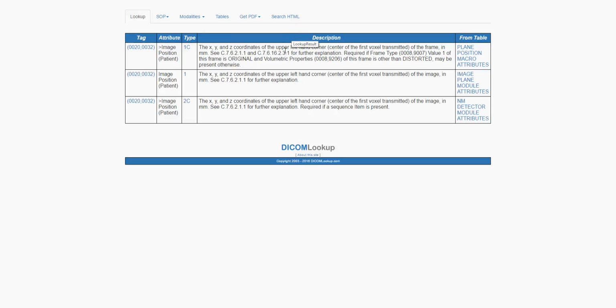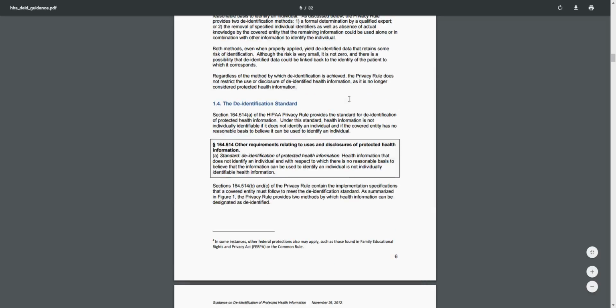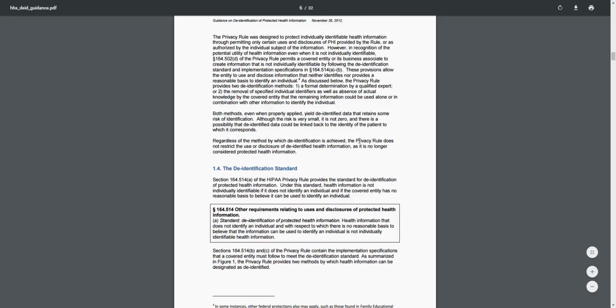And before we go and look at some actual data, one other important thing is to understand anonymizing data, and what that is: removing all relevant information that could be used to trace back to you or the person that was scanned. And so if you go to this website, which will be linked below, and then you click on this PDF, it brings up this document. It's a short overview. But the important thing is to understand what proper de-identification of data looks like.